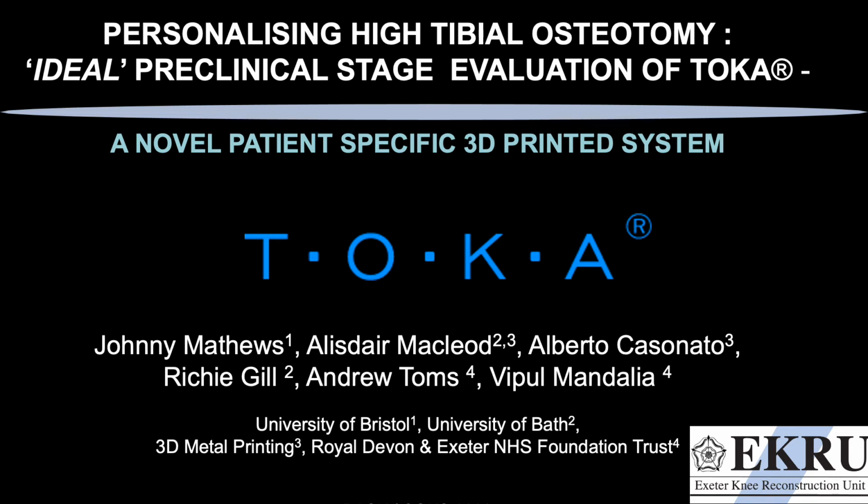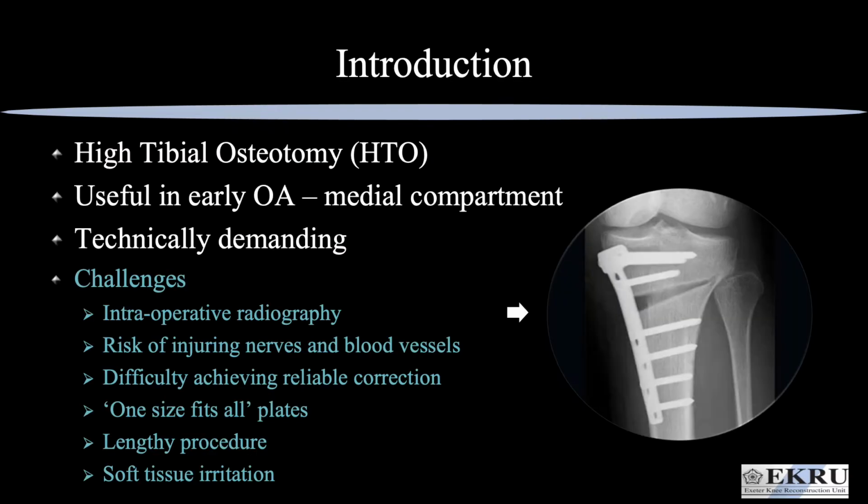Morning, I'm Johnny Mathews, Registrar, and I'll be presenting a cadaveric assessment of Toka, a novel personalised system for high tibial osteotomy. Now, high tibial osteotomy represents a useful surgical option for medial compartment OA in younger, more active patients. It is technically demanding, and accurate correction in multiple planes is essential for optimal effectiveness.